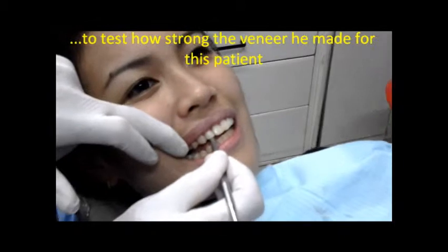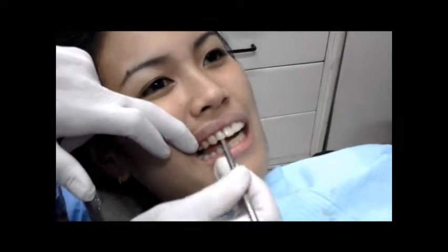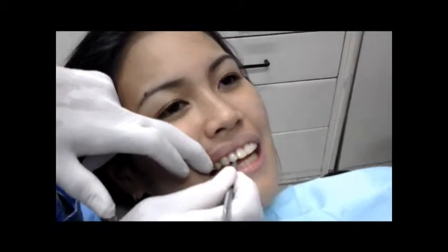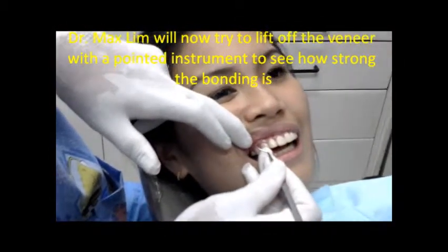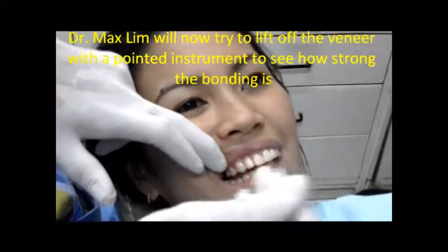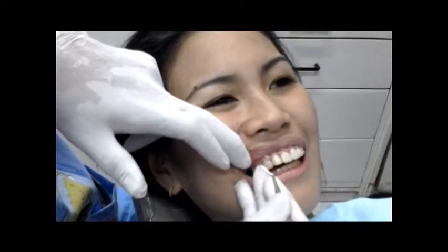Then I'll try to take it out — it won't fall off. I'll try to lever it off and see if it goes. No, it's pretty strong. Okay, so I think it speaks for itself.